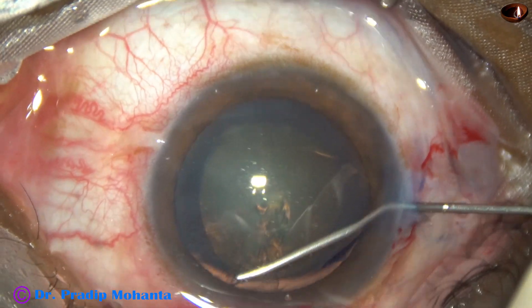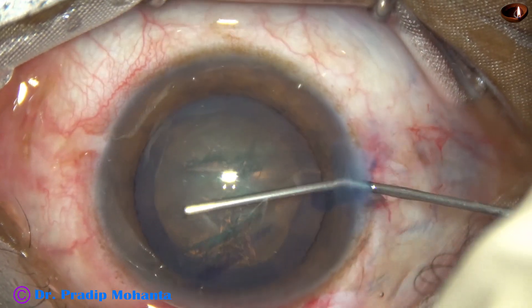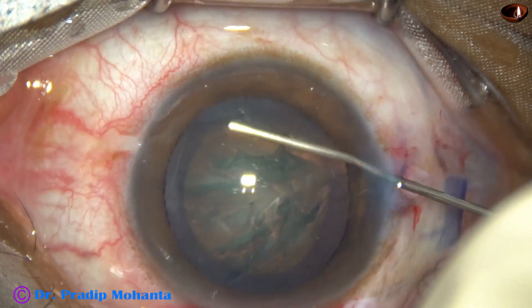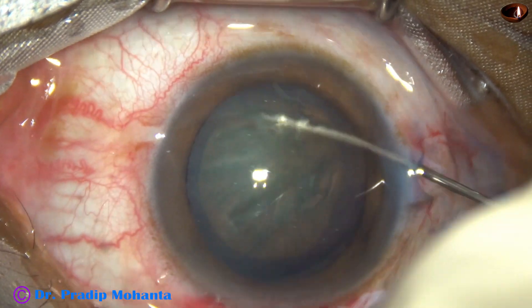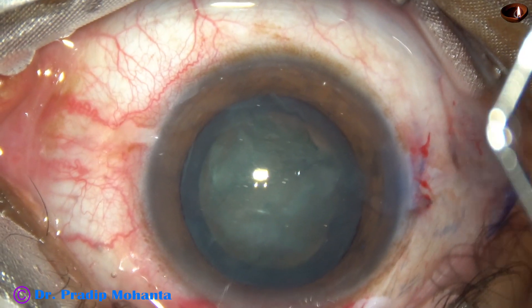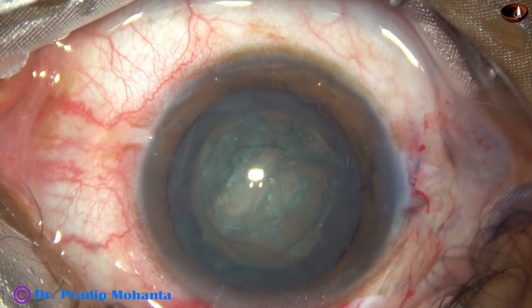Now I do hydrodissection, and then the nucleus is mobilized. The nucleus rotates nicely. Then the chamber is again filled with visco.